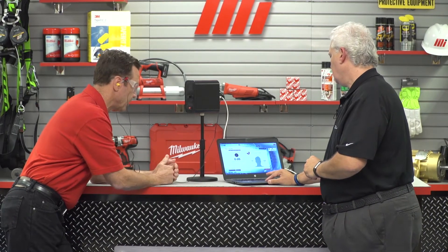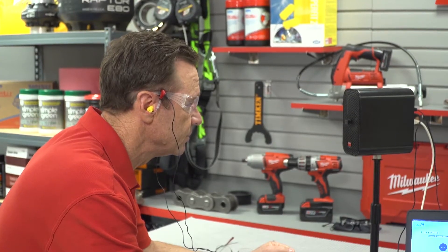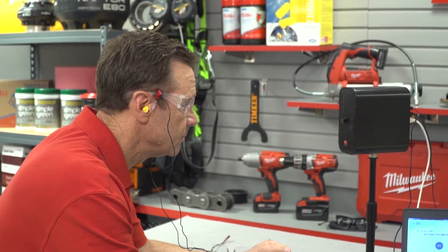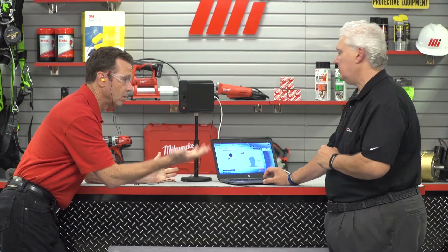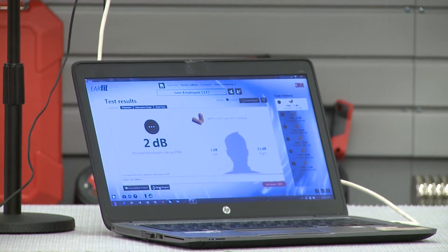What am I going to be looking at here? You just stare straight ahead and you'll hear about three seconds of white noise. That's it? That's it, Tom. We're all done.